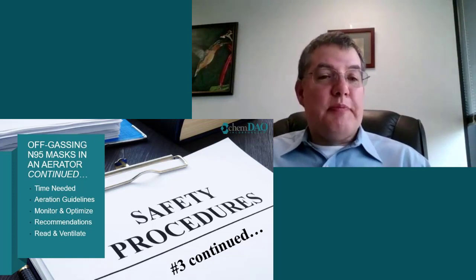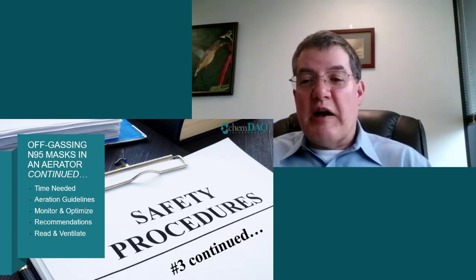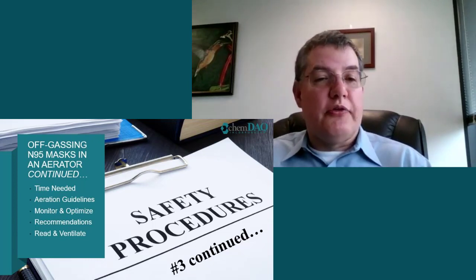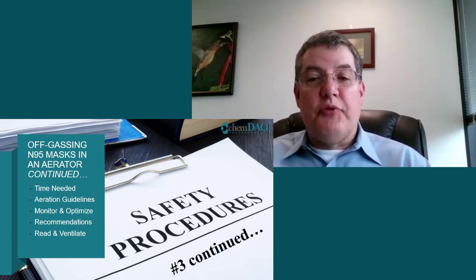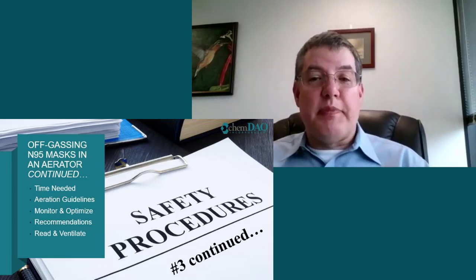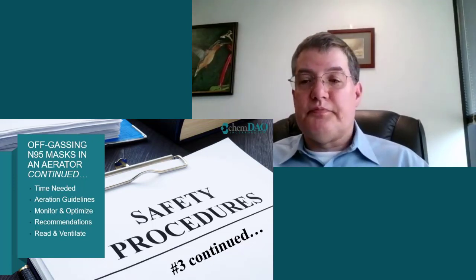There are other challenges that facilities need to consider when reprocessing N95 masks. In particular, it needs to be a dedicated space. The masks should not be stored in the prep and pack area of a sterile processing department, since they are contaminated and risk contaminating the environment where surgical instruments are exposed to the air. Conversely, since the masks cannot be cleaned, they cannot be taken into the decontamination room, since they may absorb or be exposed to additional contamination. Therefore, a dedicated space for reprocessing the N95 masks is needed.